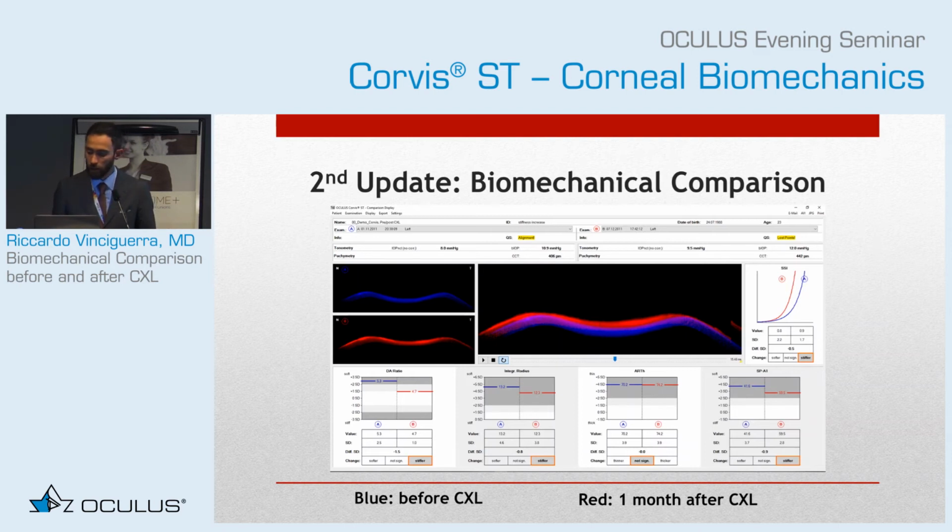We expect that. And the stiffness parameter and stress strain index are all significantly different. It's not always the same. So you should not expect to have all the indexes always significantly different. But even if you have one or two that are significantly different, then it's still telling you something.